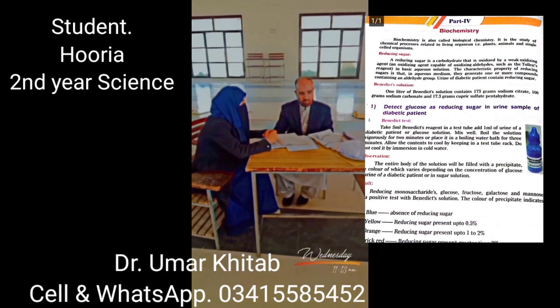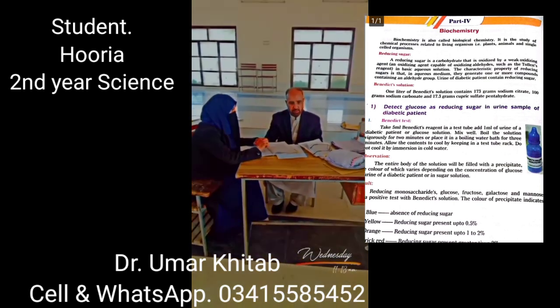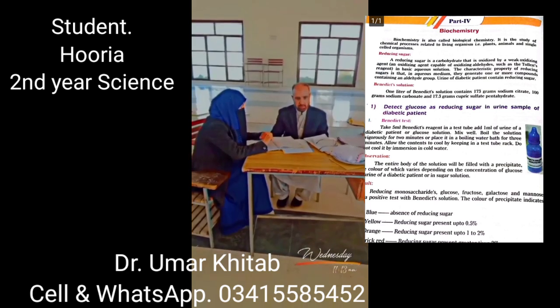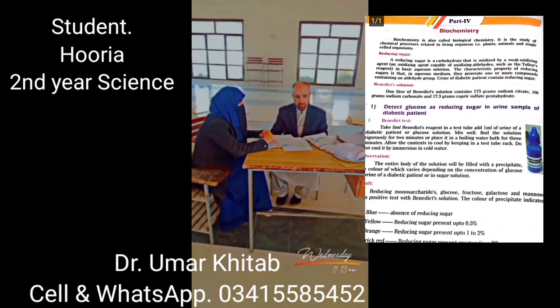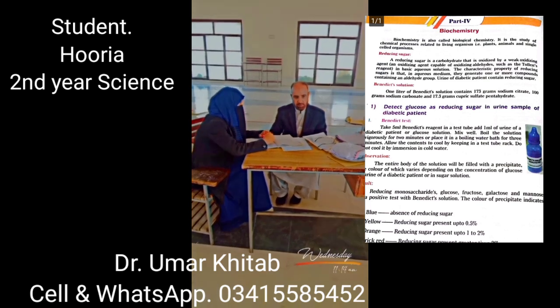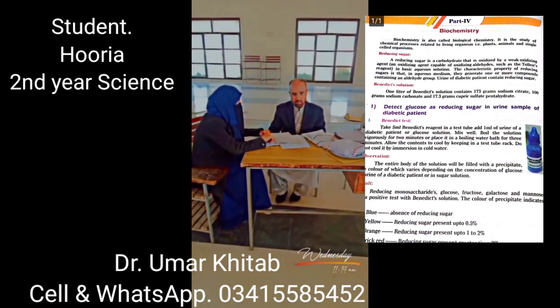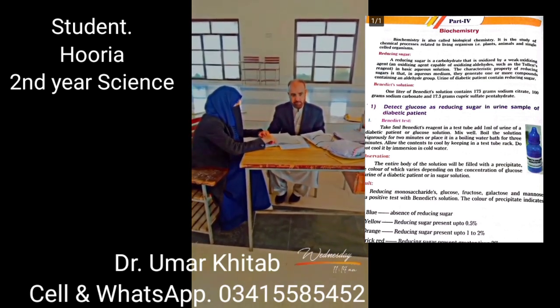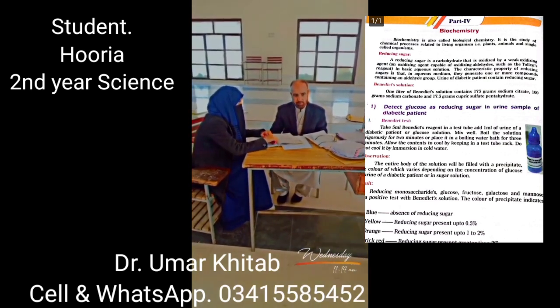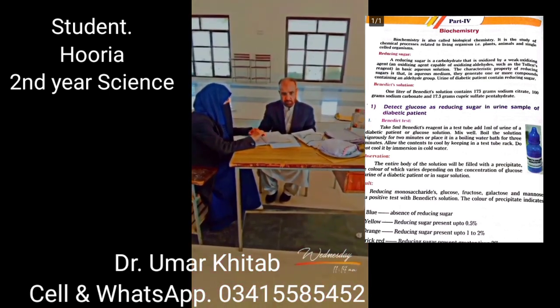Now we are starting observing the change on heating the sample. The presence of sugar is indicated in the sample of urine when a green precipitate is formed in the test tube, which denotes a trace of reducing sugar. Different precipitates are formed depending upon the sugar concentration in the urine.